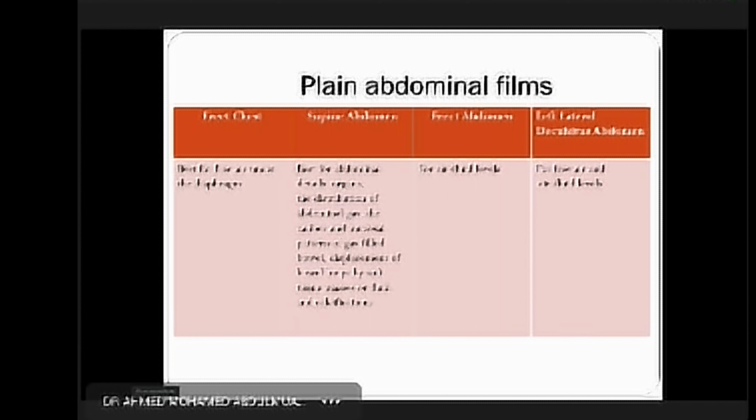Michelle? Because on the right side there's the liver, so you would ask the patient to lie down on the left. Why?